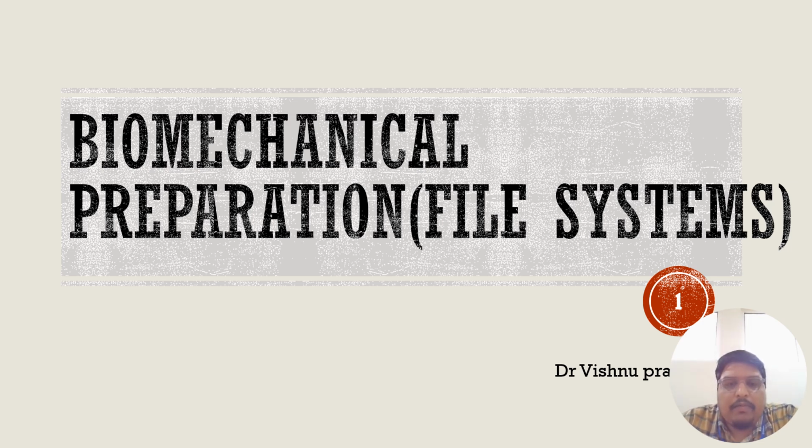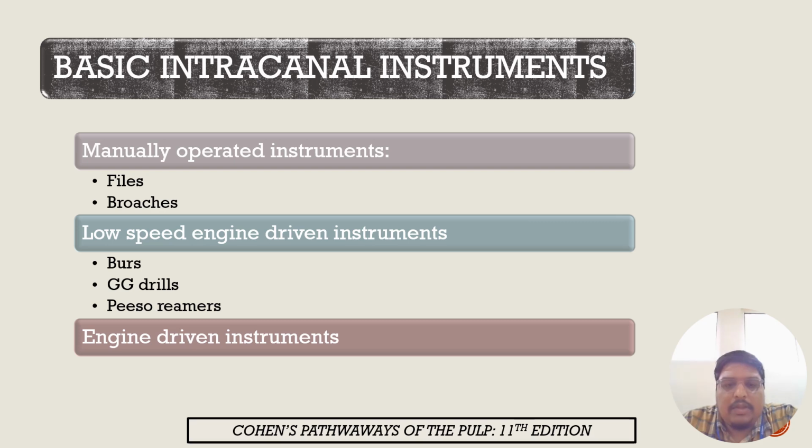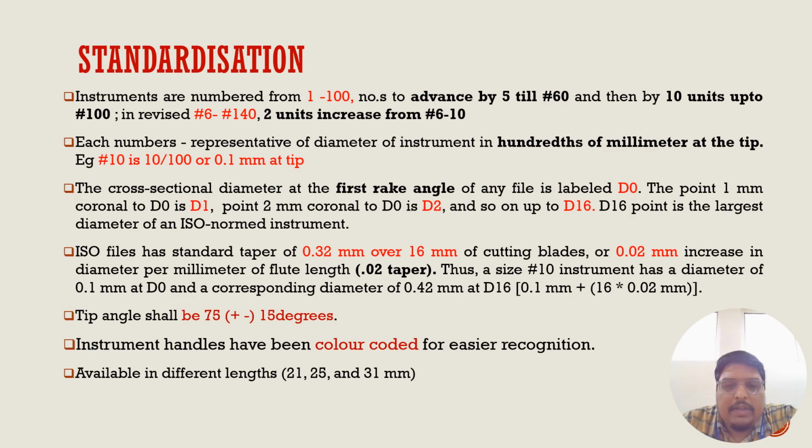Good morning to all. The topic of my presentation is biomechanical preparation, which includes the preparation of the root canal system by mechanical objectives and its biological objectives. And the instrument types, which include basic intracanal instruments: manually operated, low speed operated, engine driven.